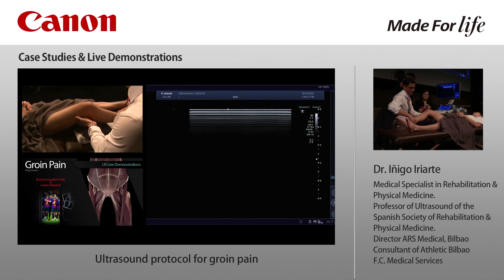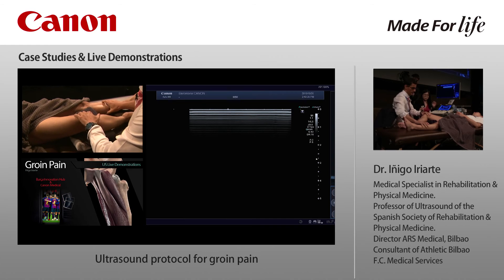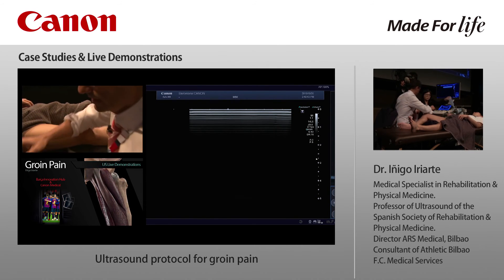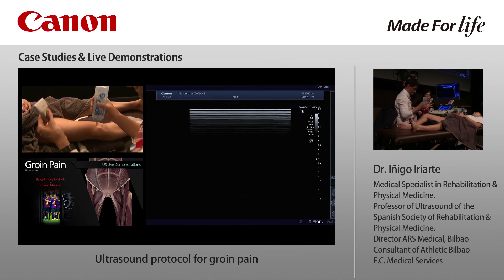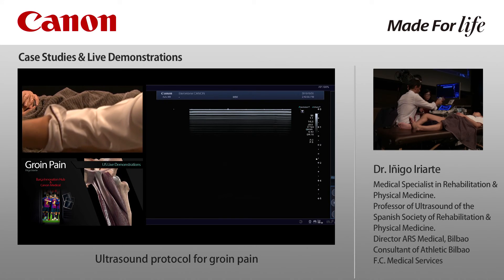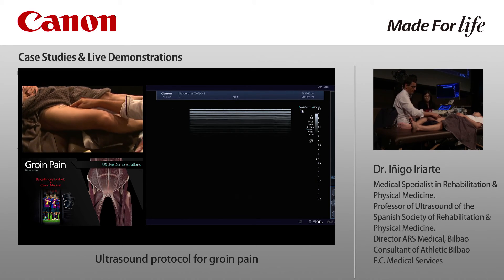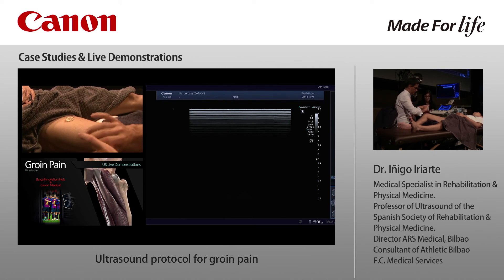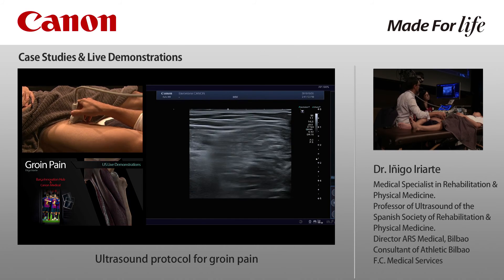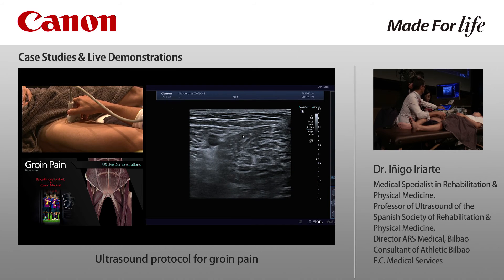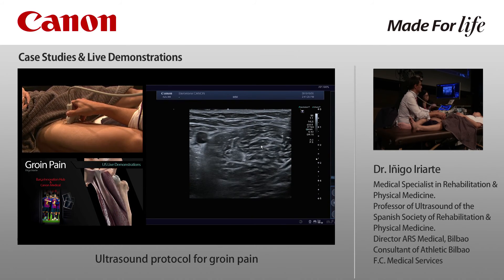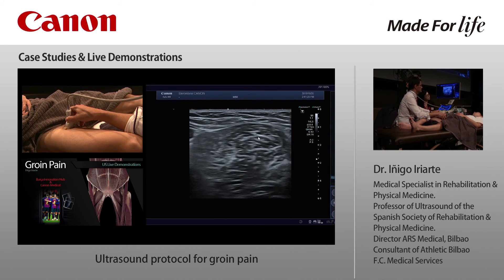We will place the patient with the lower limb externally rotated to have better access to this area. I usually use a wider probe because I have a better view of all these muscles. We have here a muscle — this will be the adductor longus. If I place the probe in short axis over this muscle, we will notice this round-shaped muscle. This is the adductor longus. You can see here this tendon inside the muscle, which is the adductor longus tendon.